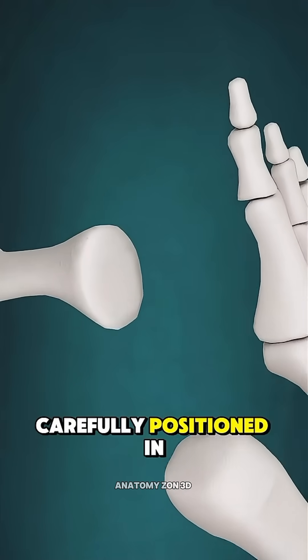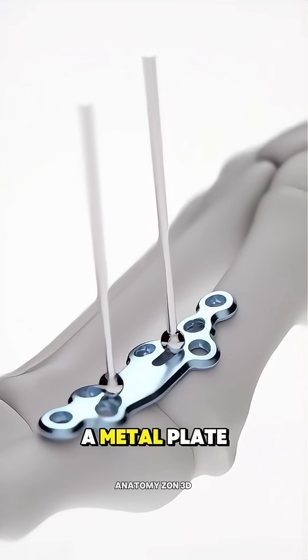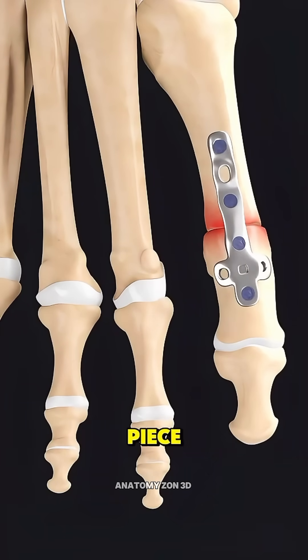Next, the toe is carefully positioned in the proper alignment so it points straight and supports your weight evenly. A metal plate and screws are placed across the joint to hold the bones firmly in place while they fuse into one solid piece over time.